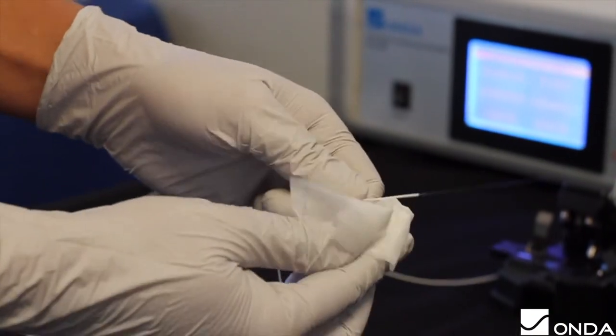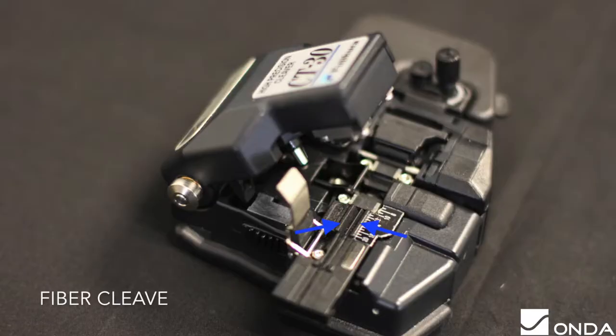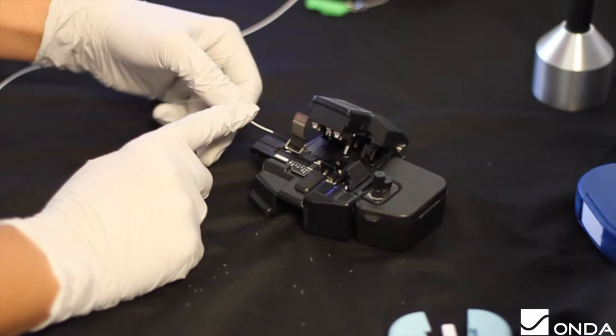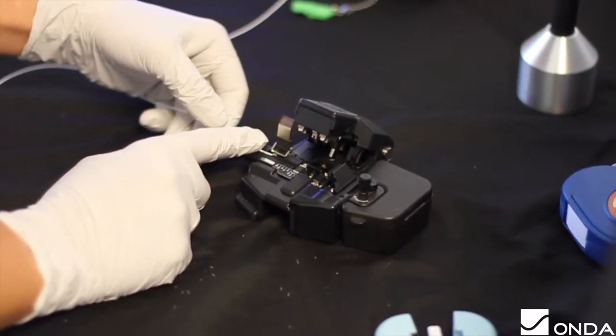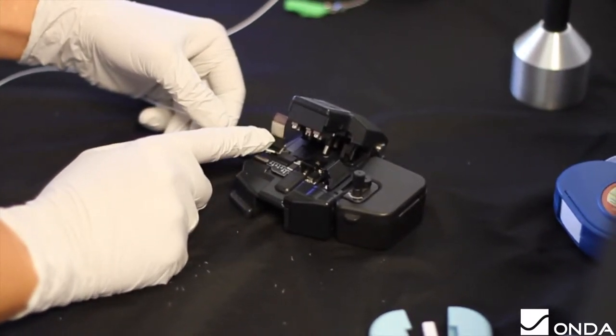Clean the fiber with IPA-soaked Kim wipes before cleaving the fiber. You can pick between two tracks in the cleaver depending on the fiber tip length and application. A shorter fiber is recommended when used for scanning as it will be more insensitive to movement, while a longer fiber is recommended for continuous wave to avoid reflections from the holder. We recommend reducing the length to 10mm for better results.